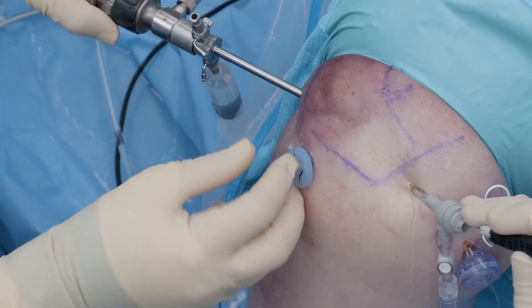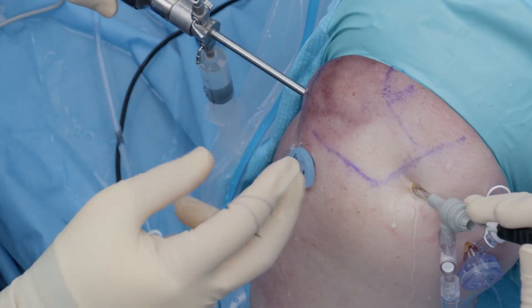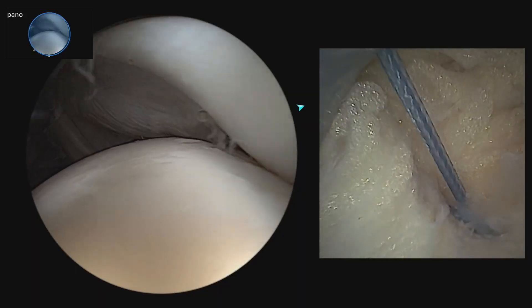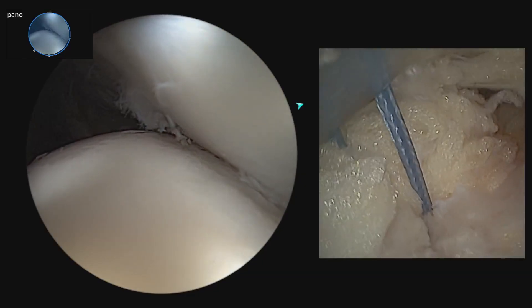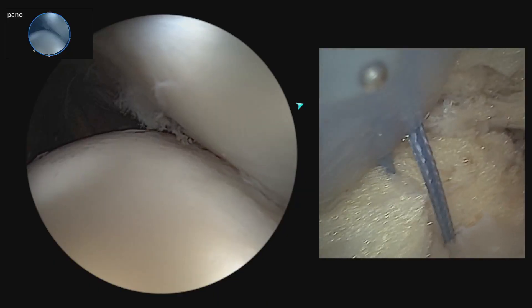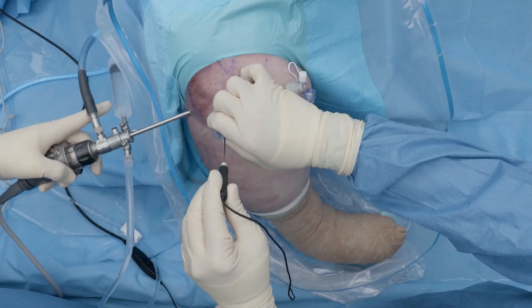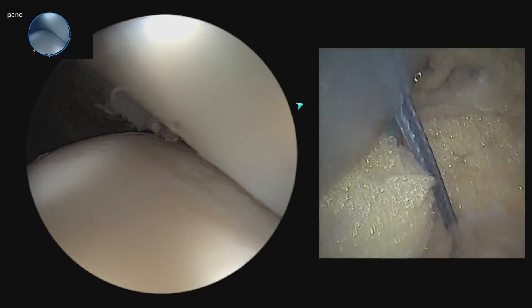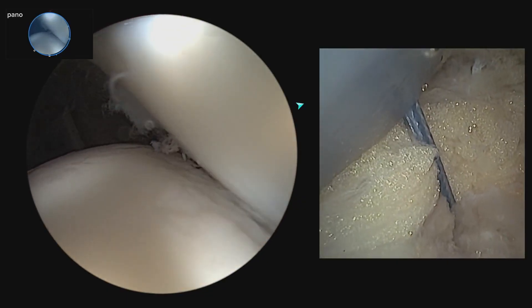Now we finalize the tension on the remplissage while visualizing both intra-articularly and from the subacromial space. We've confirmed from both above and below that we have excellent reduction of the infraspinatus into the Hill-Sachs defect, completing the remplissage, and we are very confident that we have good fill and good tension from both sides.